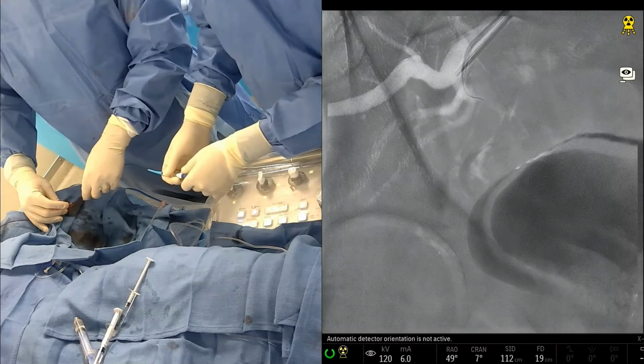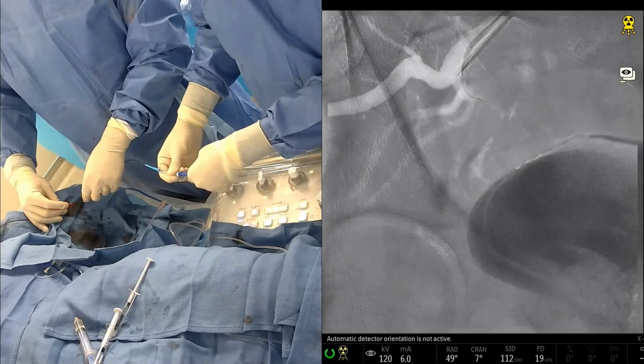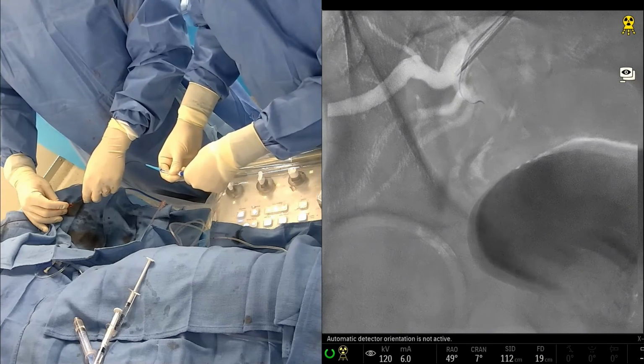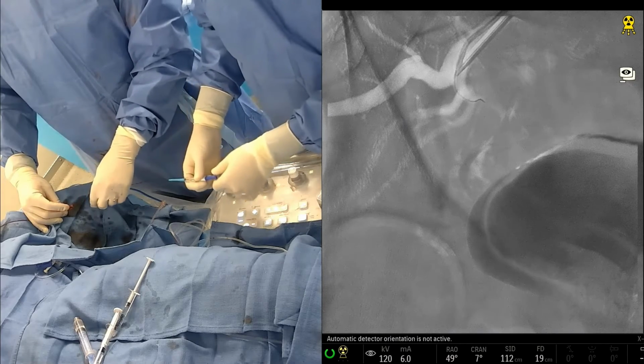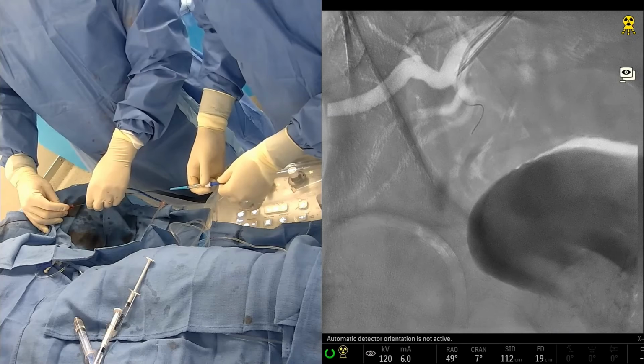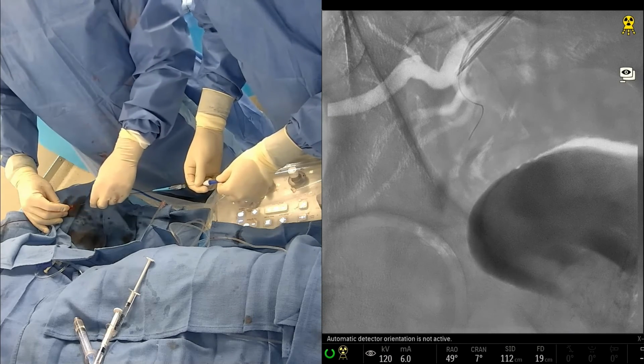So Puneet's going to spin the wire and see if it just flies down there as he pushes. Or I can just track it and go in there. Hey, you know what? Let me follow you. Put a little back tension on that so I can follow you. One thing about that True Select, there it is. Look at that. Nice. It's trackable. You don't necessarily need that much wire ahead of you, but that's awesome.